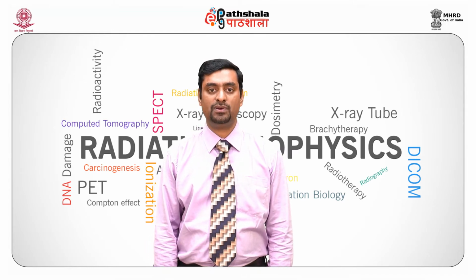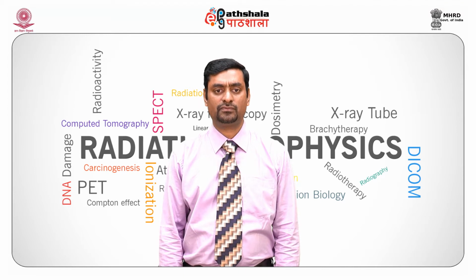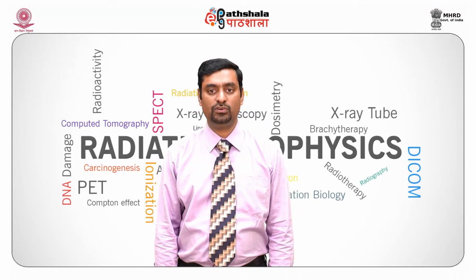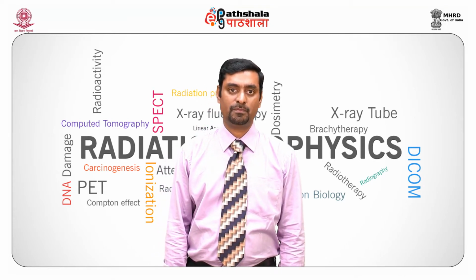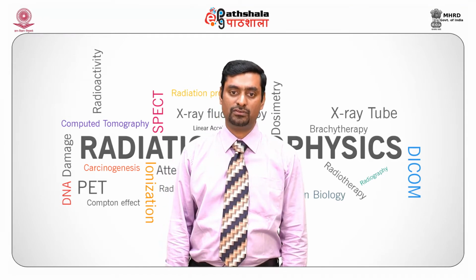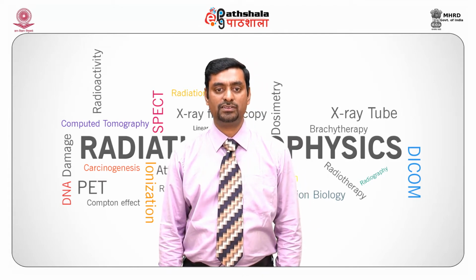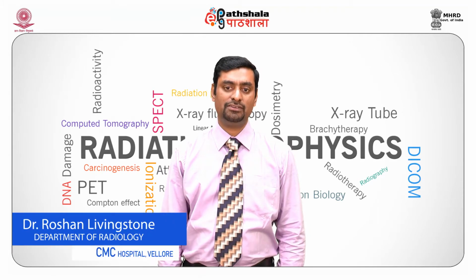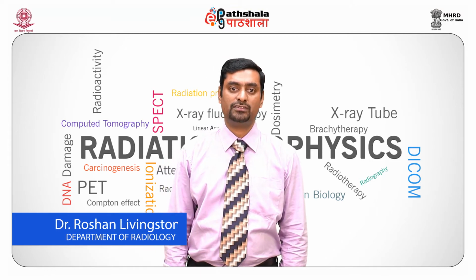Let's go step by step on this fluoroscopic imaging chain. The X-ray generator. The work of the X-ray generator is to enable selection of kilovoltage and tube current, that is kV and mA, for the X-ray tube. The kV and mA can be altered using automatic brightness control, called ABC. Now, why do we need automatic brightness control? It maintains the overall image brightness at a constant level as the image intensifier is spanned across different parts of the body.